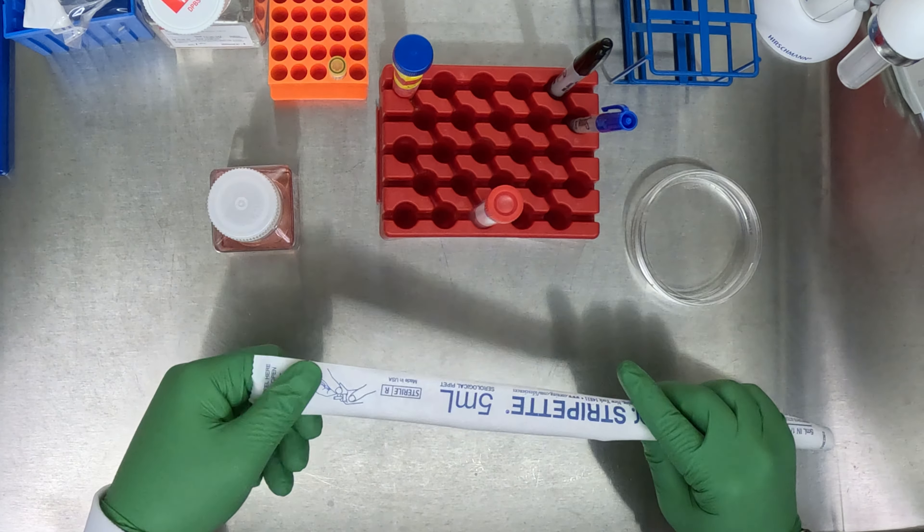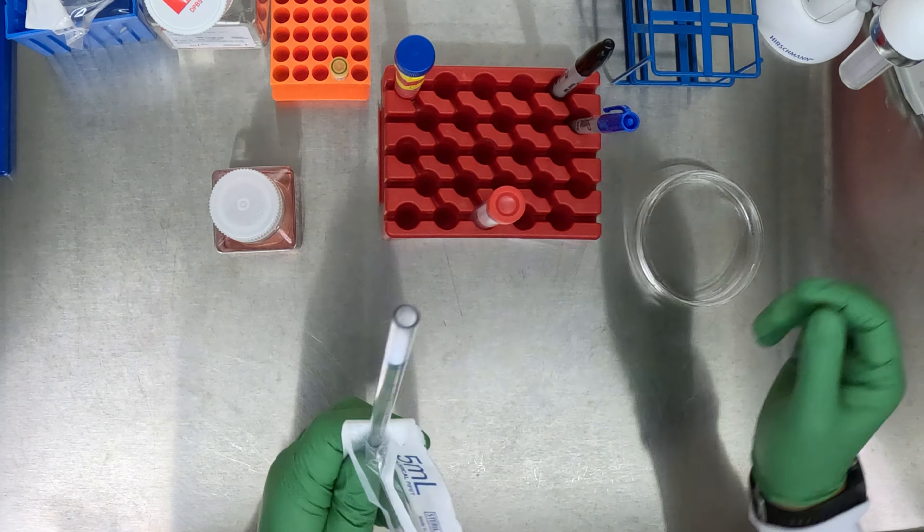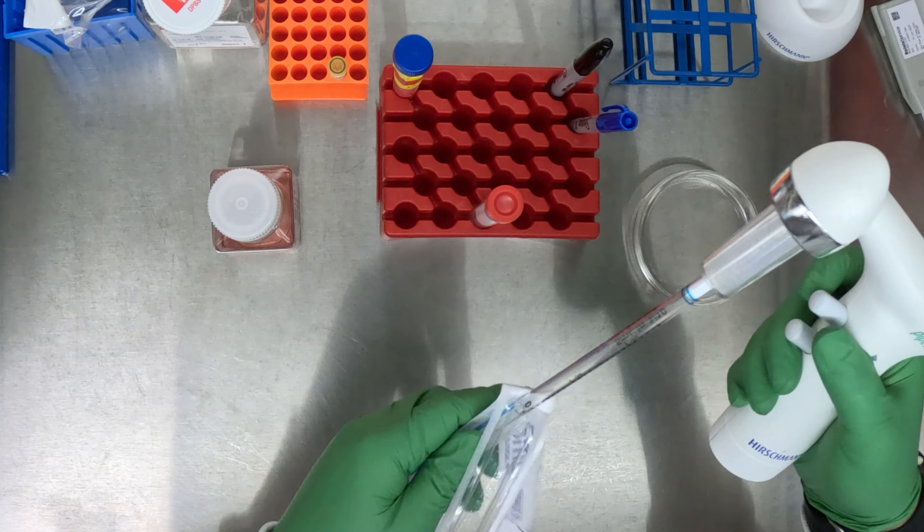It's very important to do this in a clean biosafety cabinet, always remembering aseptic technique.